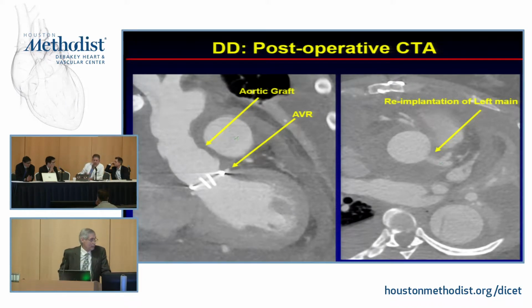Yeah, let me ask you a question, John. If you had an algorithm which would tell you what kind of valve that was based upon the appearance of it, automatically, so that we could show you a picture of what the surgical valve looked like, is it helpful to you? Can I tell the type of valve? Well, it's a mechanical valve. I can't tell, I'd have to thicken the slices, then I could tell you exactly what valve it is.